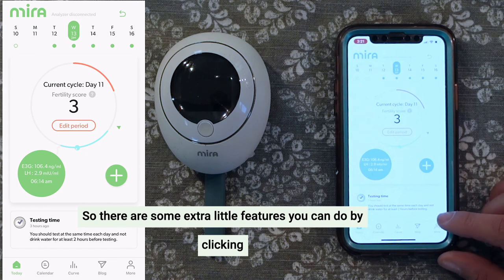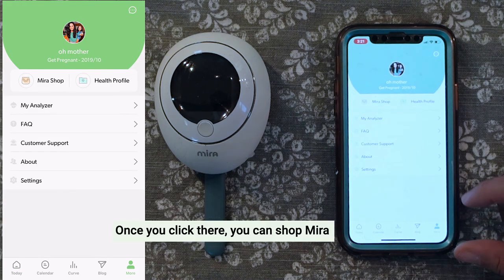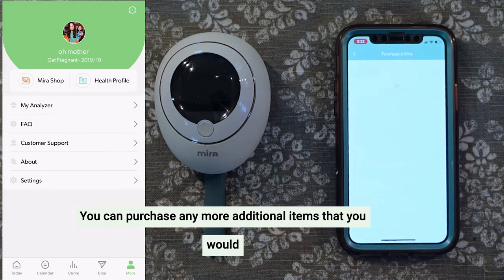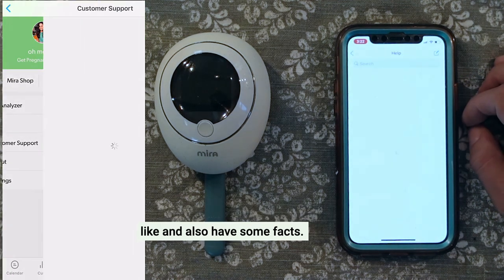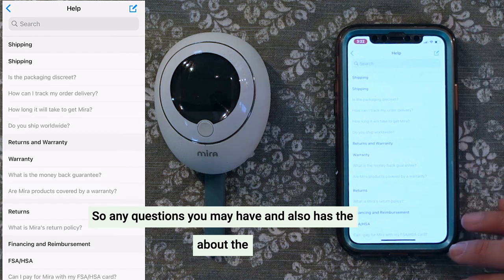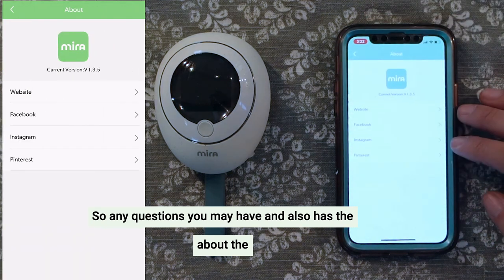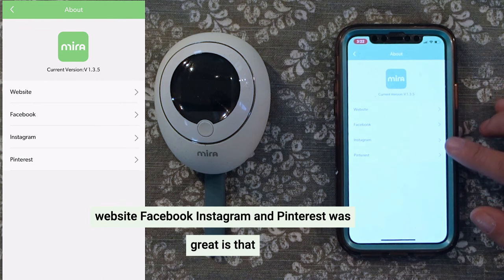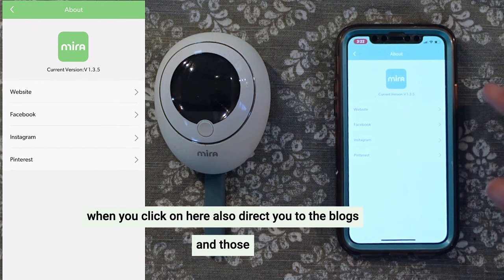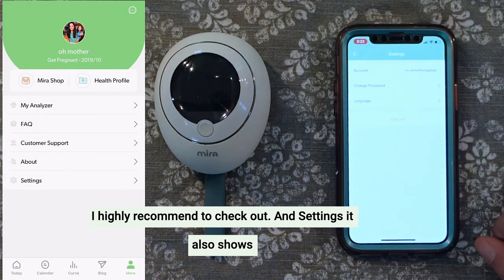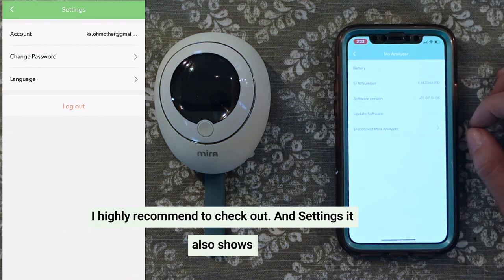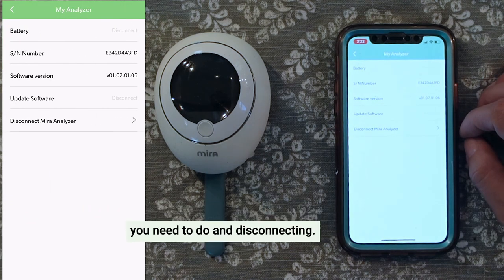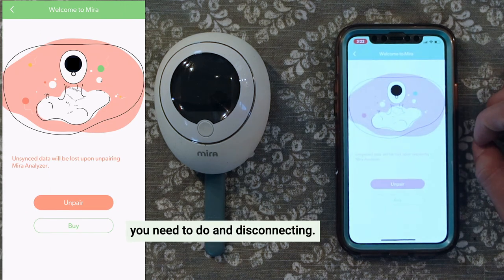There are some extra features you can access by clicking the More button. Once you click there, you can shop Mira, purchase additional items you'd like, and also access some facts. It also has the About section, the website, Facebook, Instagram, and Pinterest. When you click on here, it will also direct you to the blogs, which I highly recommend checking out. Your settings also show your battery life, device number, any updates you need to do, and disconnecting.